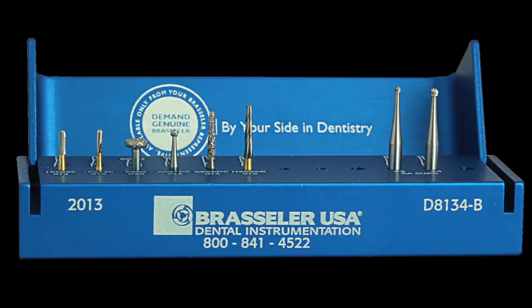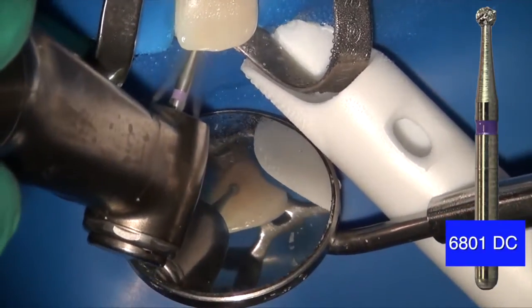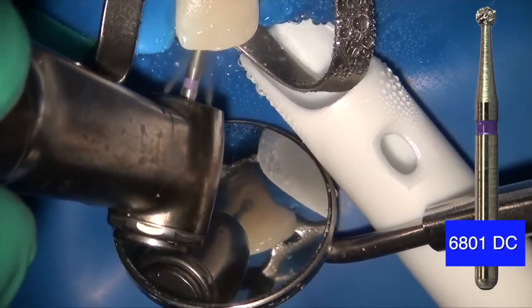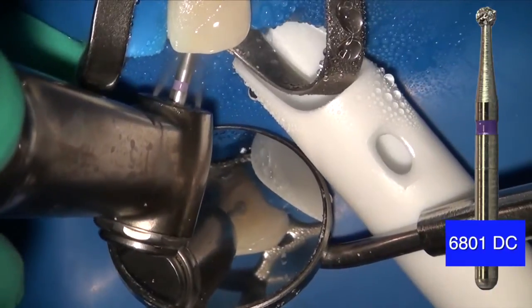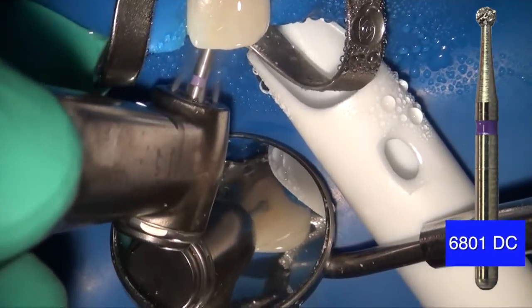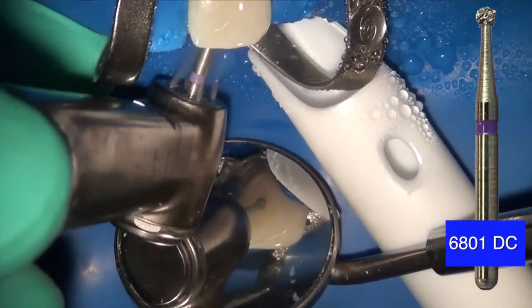I use the Real World Endo Access Kit. This is the modern access kit, which includes burrs such as the 6801 DuraCut. What the burr does is it allows access through some of these modern crowns. As you can see here, this one is a lithium disilicate crown. And these crowns, as you know, are very hard and very difficult to access through.